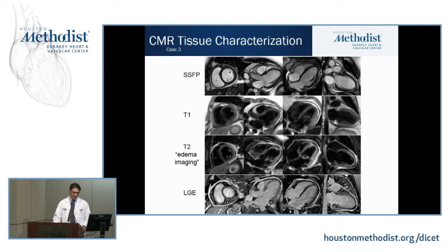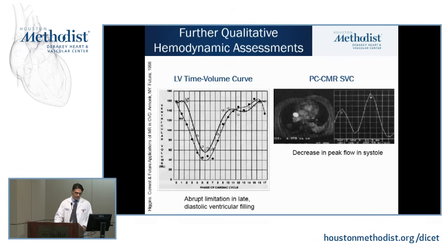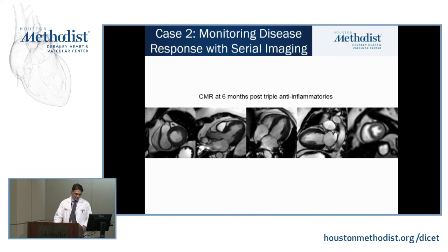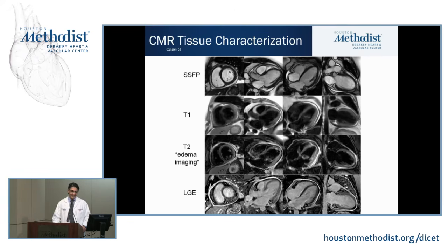And, okay, so here is another case. Yes, yeah, it's coming. Okay.